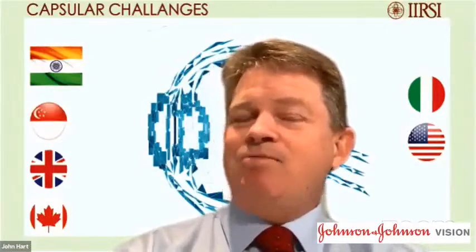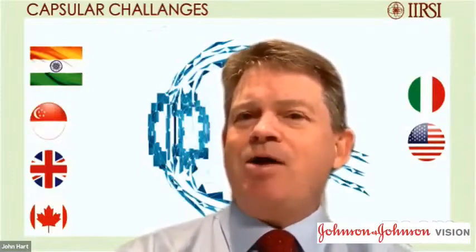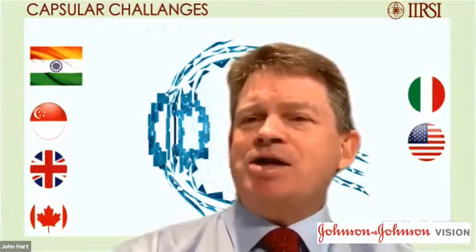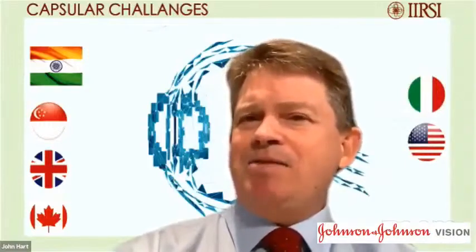So, beautiful case. The one thing I would add when making any of these capsular rexis, I've seen people talking about an oval capsular rexis. I still like to make my capsular rexis round and smaller than my optic, so that when I do optic capture, I also get a nice barrier separating the anterior segment from the vitreous cavity. If I have an oval opening, I'm a little bit careful that I'm not going to be able to maintain that, and that could be a source for vitreous coming around. But beautiful case, fantastic case.